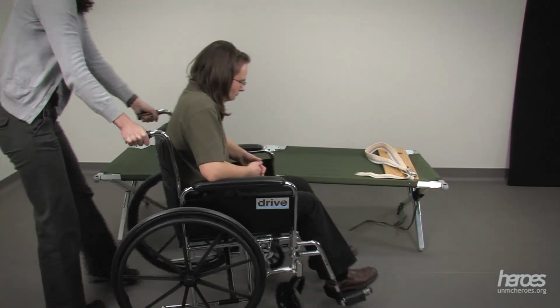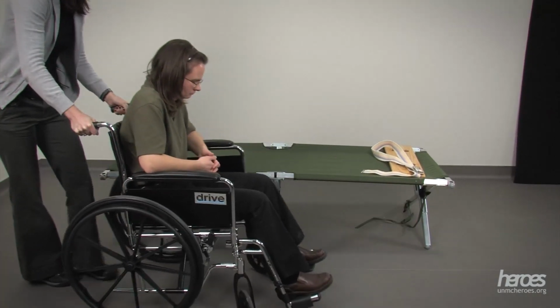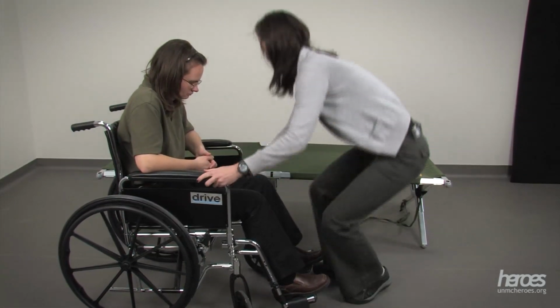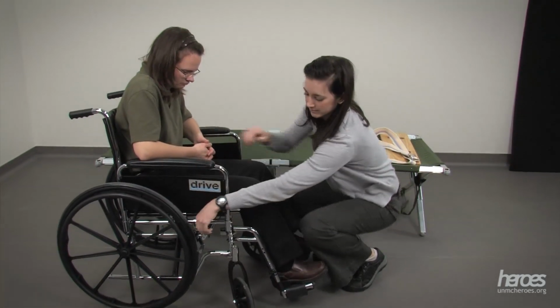In this video, we will demonstrate how to use a slide board when transferring an individual from a wheelchair to a cot. Position the wheelchair at a slight angle from the cot and midway between the head and foot of the cot. Once the wheelchair is positioned, lock the brakes on both sides.